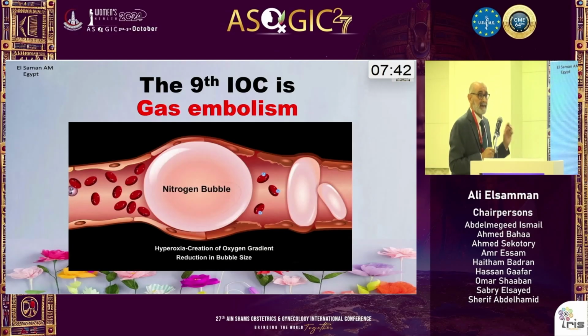Whenever you are working in a hysteroscopic theater and you see collapse of the patient, the anesthetist becomes disturbed, there is loss of saturation or decreased saturation, or sudden hypotension, this should raise the suspicion of air embolism. If the management of this problem is not in the mind of the hysteroscopist, you will lose this potential life. What do we do?